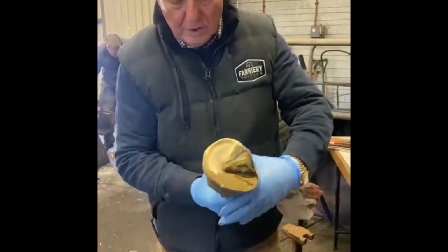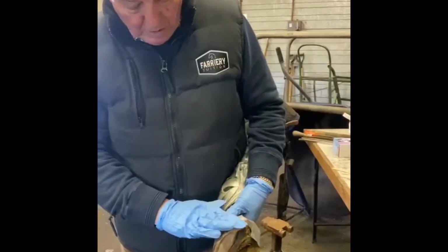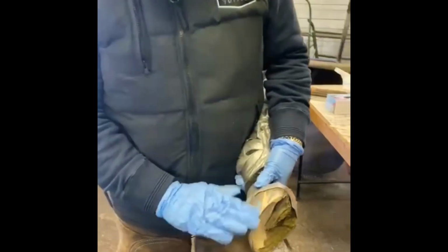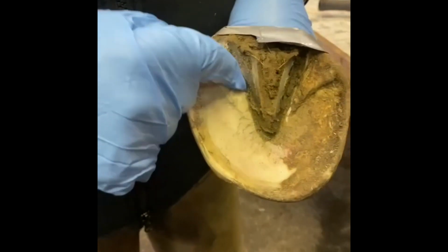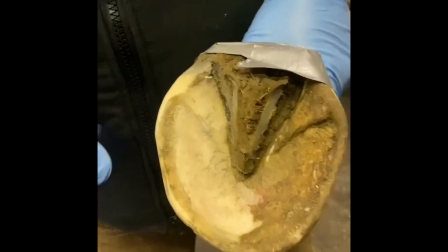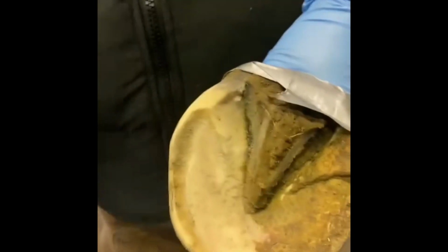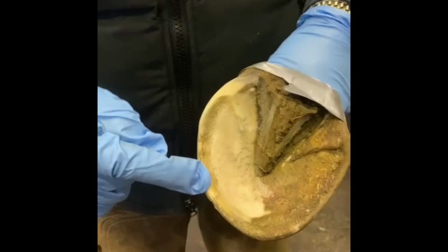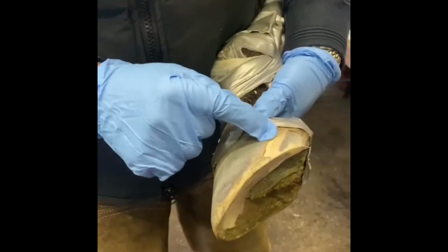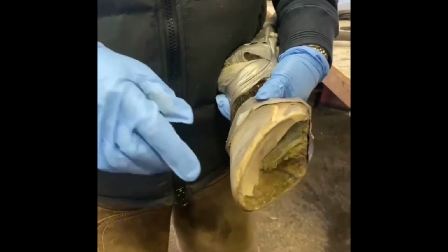So the first thing you do is to repair the wall and the sole, and you can see the external hoof has been cleaned, and also coming round to the inside, even up the inside of the bar, because I'm going to wrap the patch right the way over. It's going to hold it like your hand's holding the foot together there. So it'll come across here, and then here, and to the coronary band. And that's the aim of this patch.